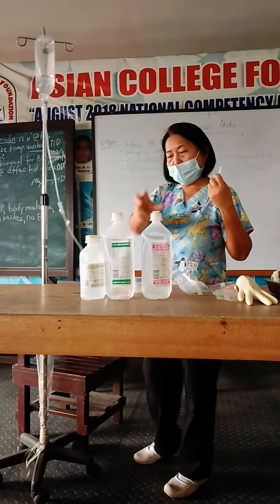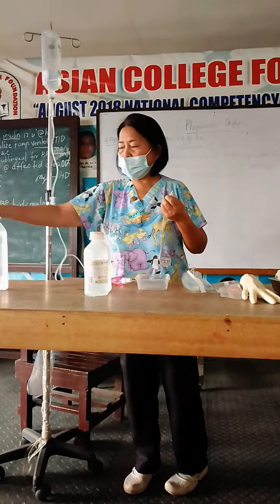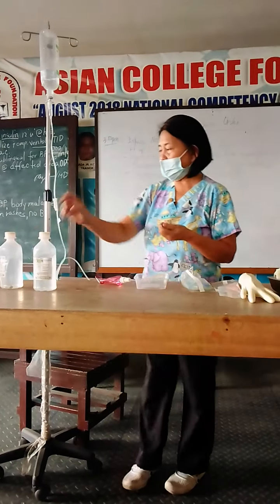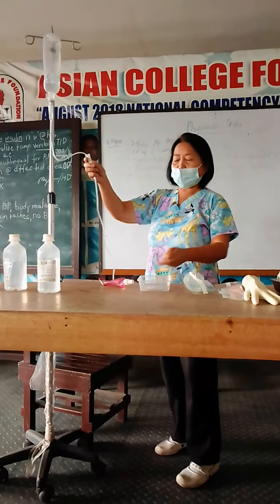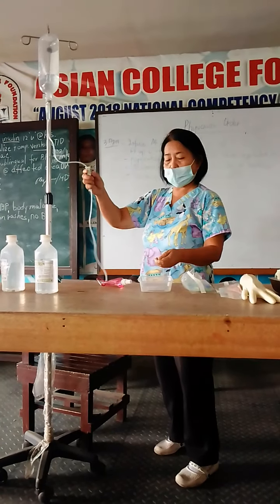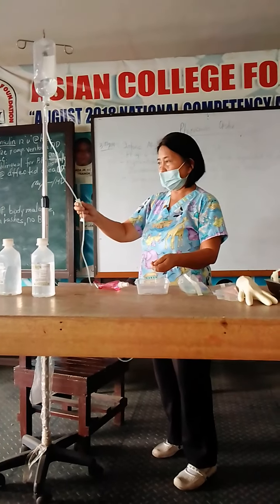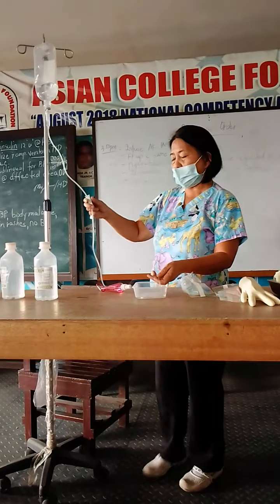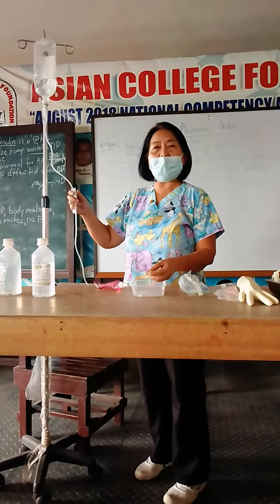I'm now going to prime the tube or the Venoclysis. This is what we call priming. Open the roller clamp, or regulator. You remove the air. We have to remove the air from the tubing in order to avoid air emboli.